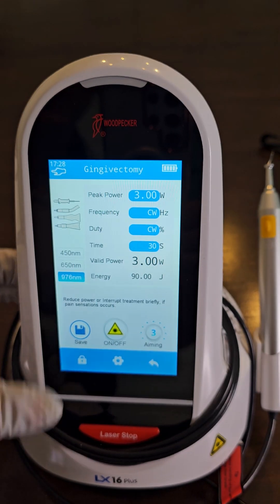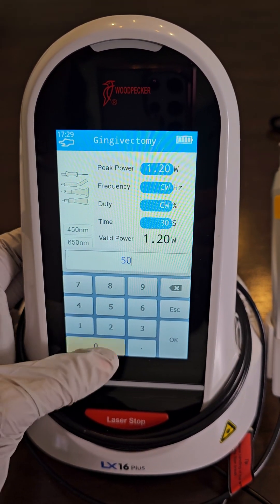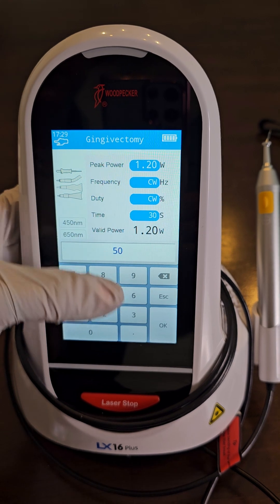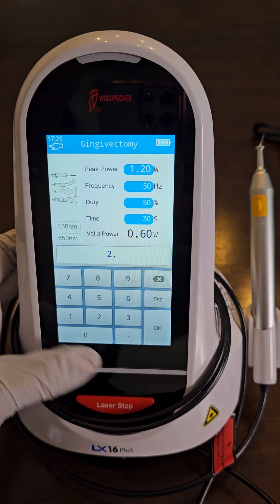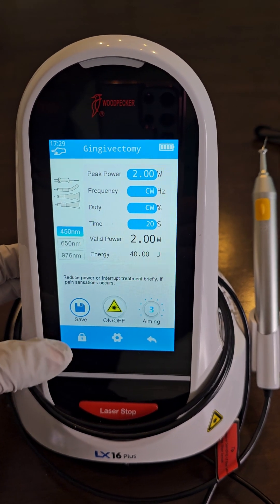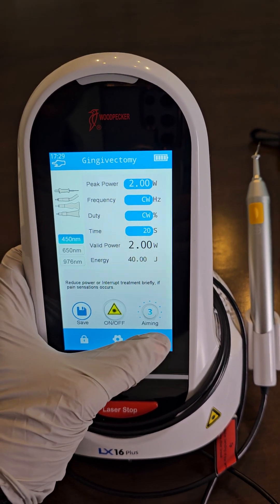For gingivectomy, enter the name and then set the power. We're going to do 2.0 watts, frequency at 50 Hertz, average power of 1 watt. We want to be on the 450 wavelength, aiming beam is on high, and we would save this. You would just go down the line for every dentist procedure.